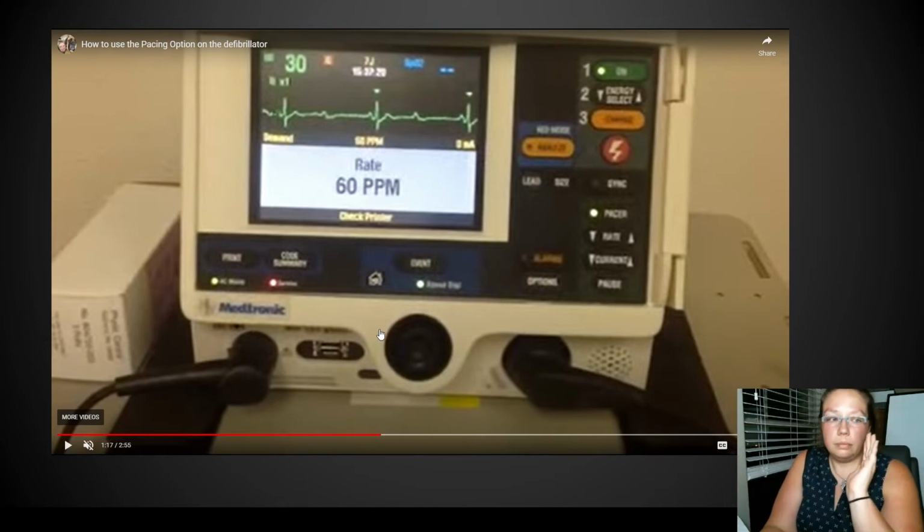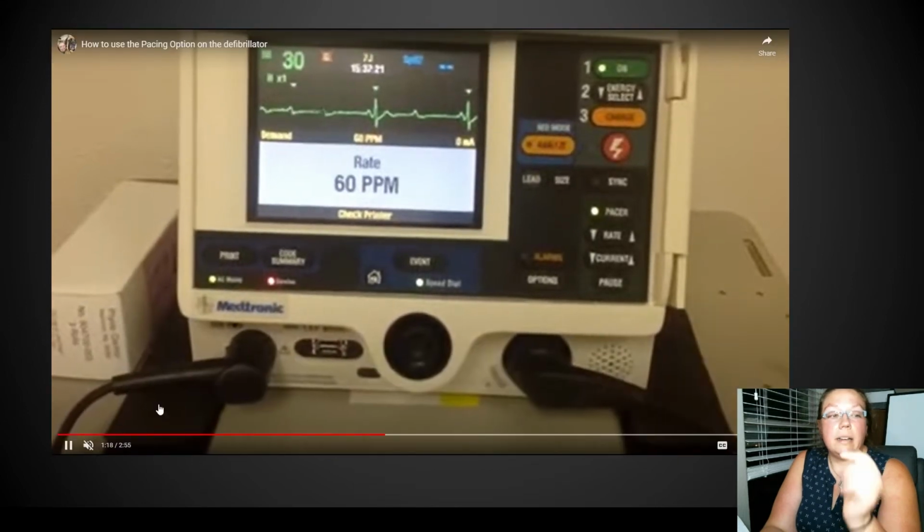So, when you are pacing your patient, or what a pacemaker does, is it sends these electrical impulses at a set rate. So what you're going to see in this video is she sets it to a rate of 60.